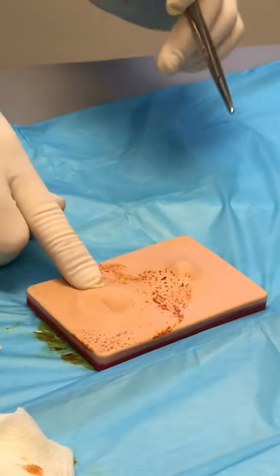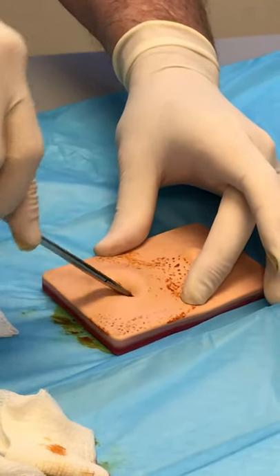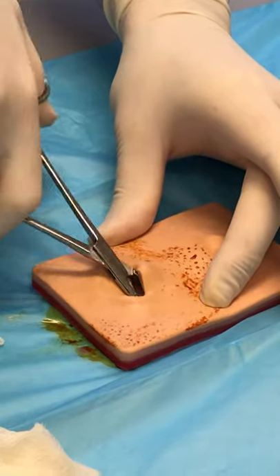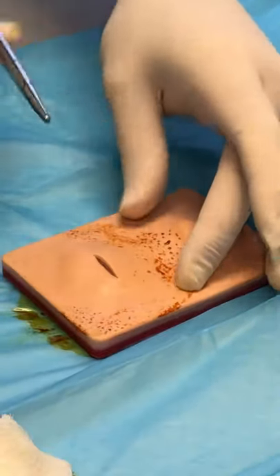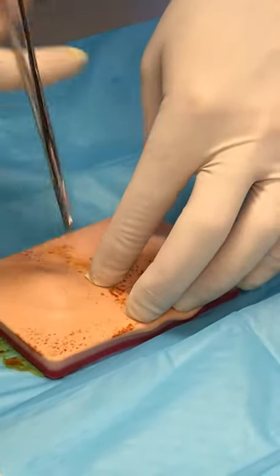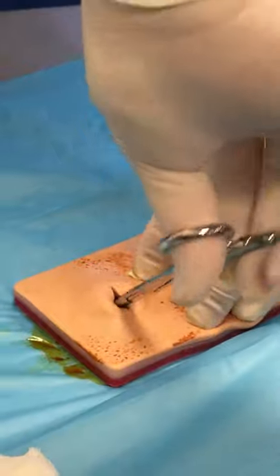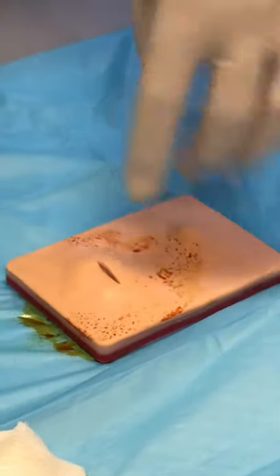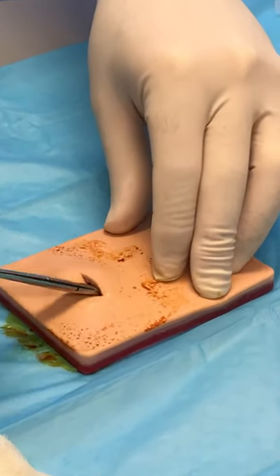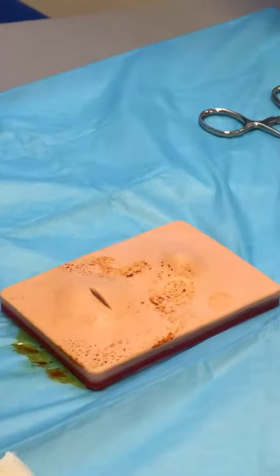Usually when you stick it, pus will start to come out immediately. If it doesn't, there's fibrinous material and walls inside. This is the part the patient really doesn't like, but it usually provides a lot of relief — the thing will pop open, pus comes out, they feel much better. Get a hemostat in there and start working around to break up anything that might be underneath to get the collections. Work your way around; use your needle driver to gently open it up 360 degrees around the wound.